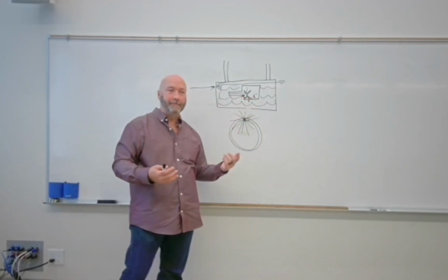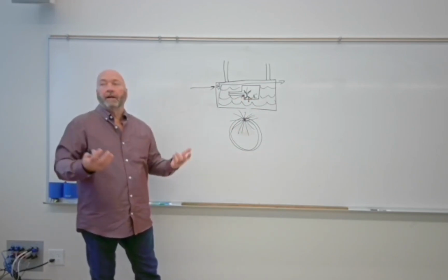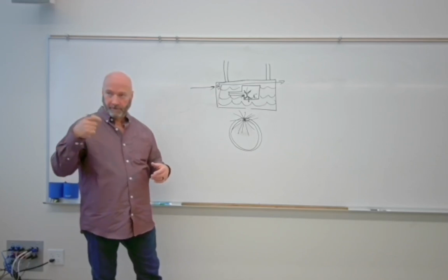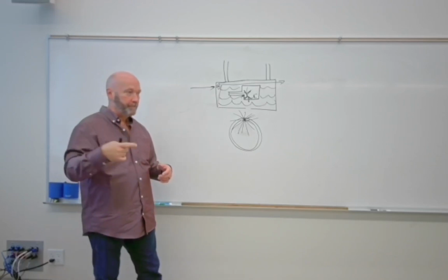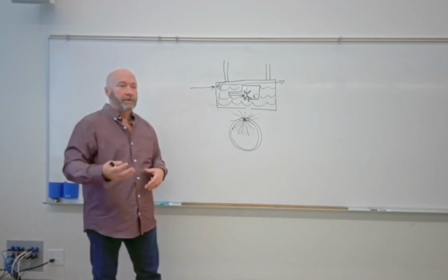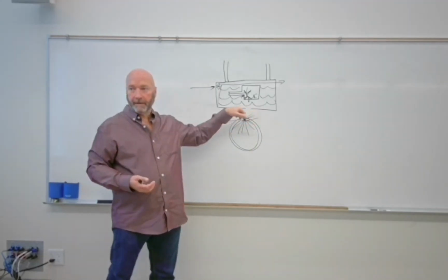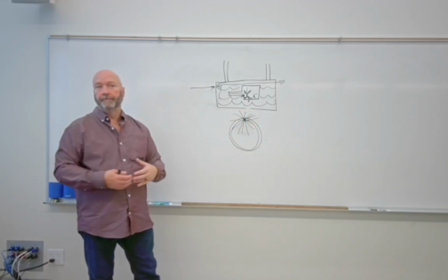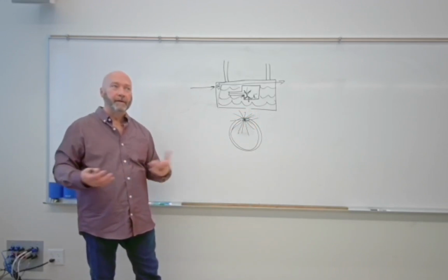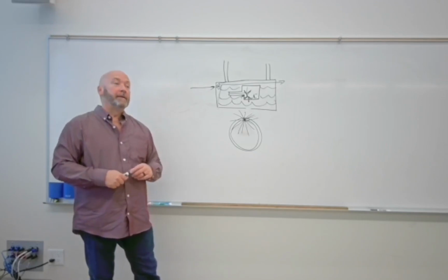You can't really see it because it's a blink of an eye, but you can see the glow, right? It starts to glow a little bit whenever he's on the prep button, and then whenever he hits exposure, there's an actual flash. So the only reason that you can see that is because there's a glass window in the housing. Okay. Otherwise, you can't see that. If your patient says that they could, I know the X-ray took because I saw the flash. No, they did not.